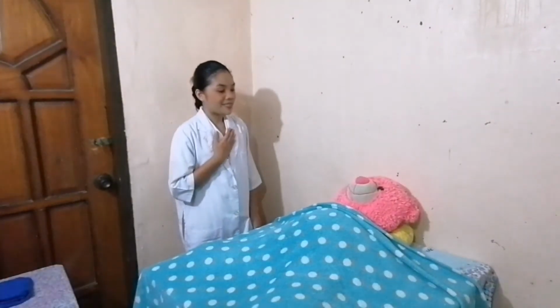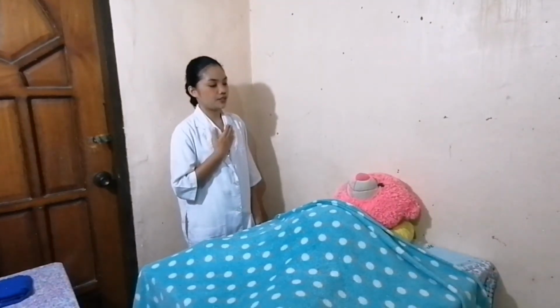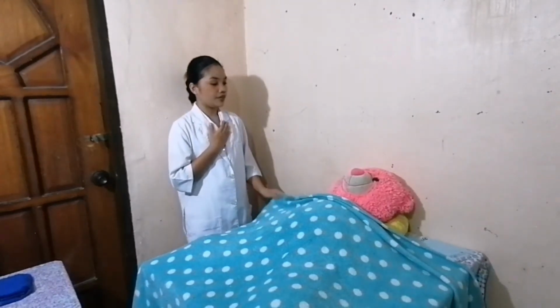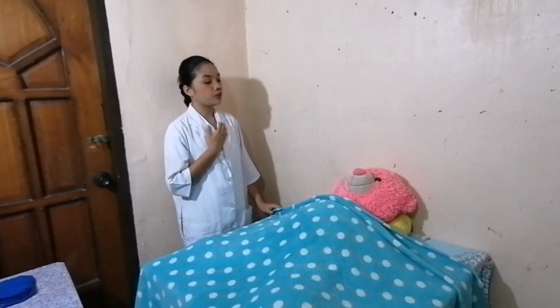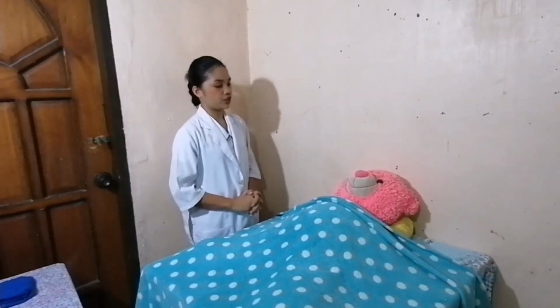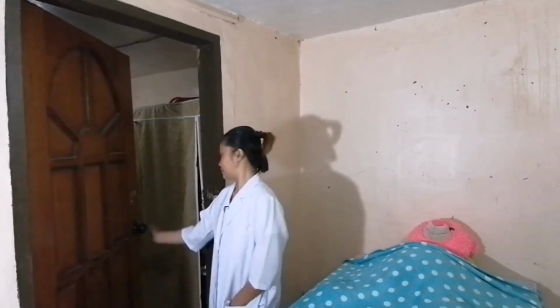Good day, ma'am. My name is C. Cavili, your nurse for today. And you are? Okay, Mrs. Smith. I am going to perform a Foley catheter insertion for you today, and I need your cooperation. Next is to provide a good light. Then gather the needed equipment for catheterization and provide privacy by closing the door and pulling the curtain.